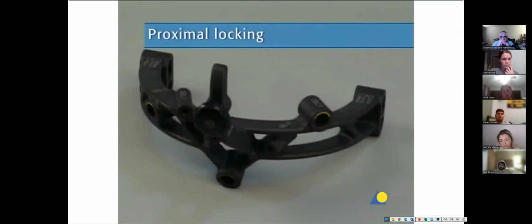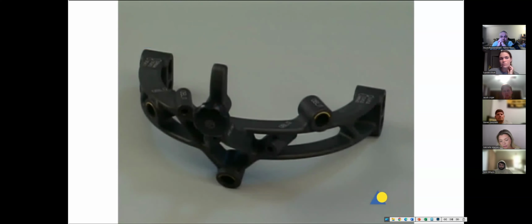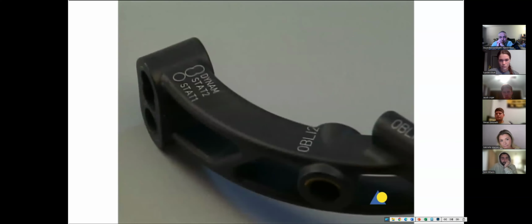The aiming arm can be used for different proximal locking options. These locking options are color-coded on the aiming arm and the corresponding instruments. 3 locking options, color-coded yellow, are combined with cancellous bone locking screws for ideal stabilization of the proximal fragment. 2 mediolateral locking options, color-coded blue and green, enable primary compression, secondary controlled dynamization, or static mediolateral proximal locking.